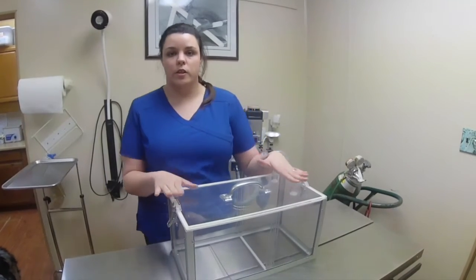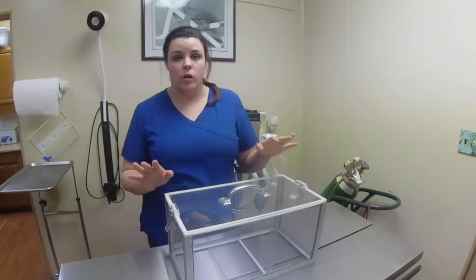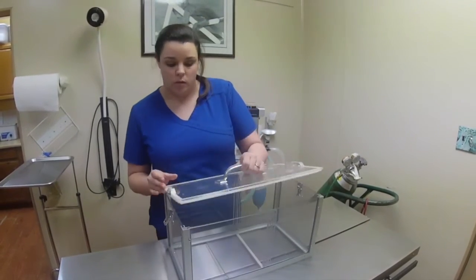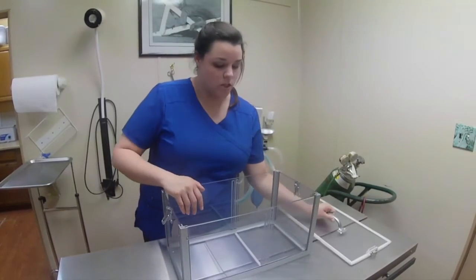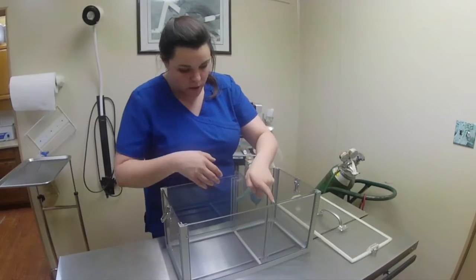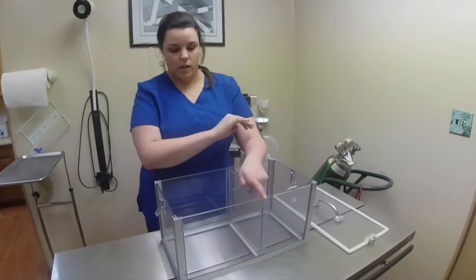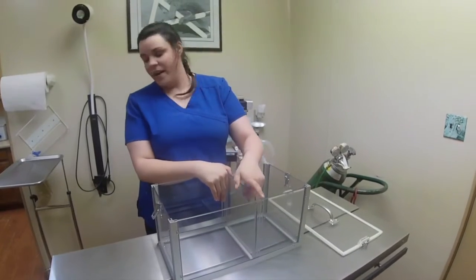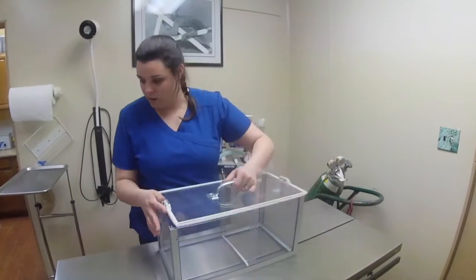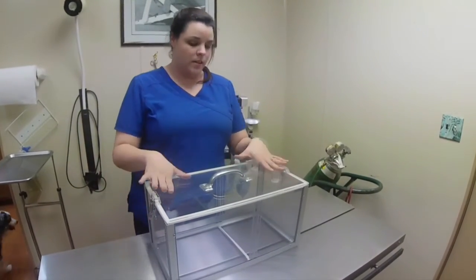Induction chamber could be used for very angry cats or little dogs that need to be sedated. If you have just a tiny patient, you can divide this induction chamber in half. That way the air only goes to half of it. Otherwise, you could leave it completely open. And you'll put your patient in there.